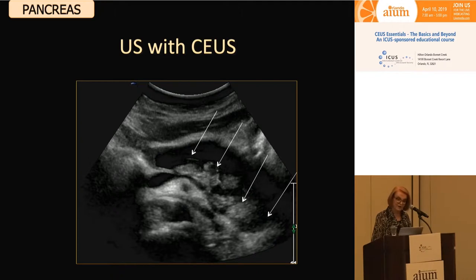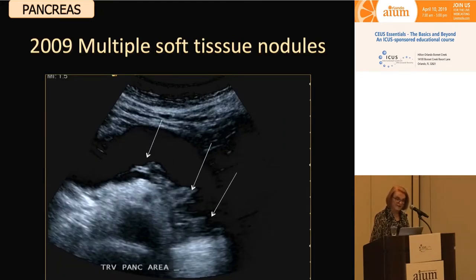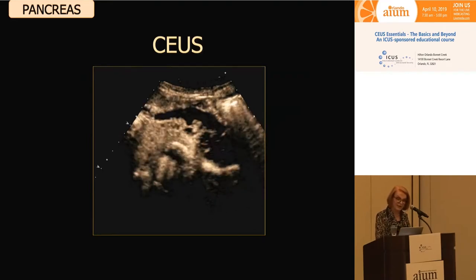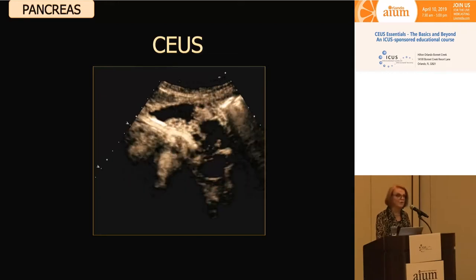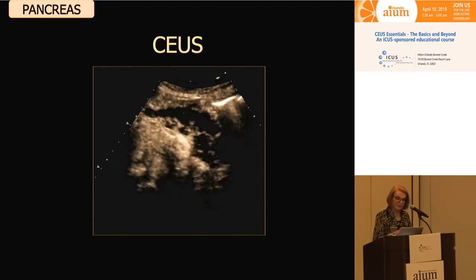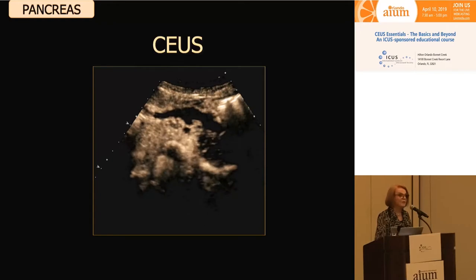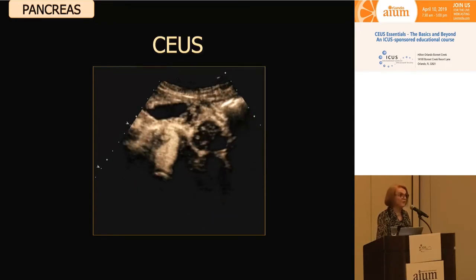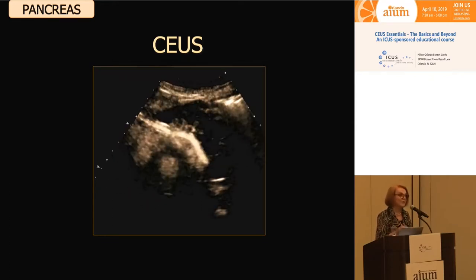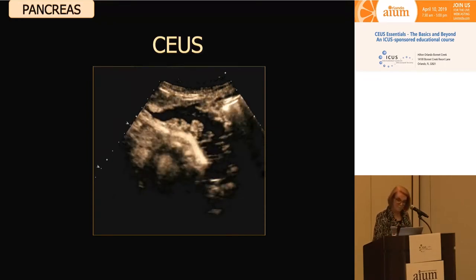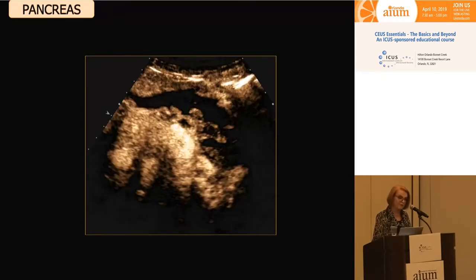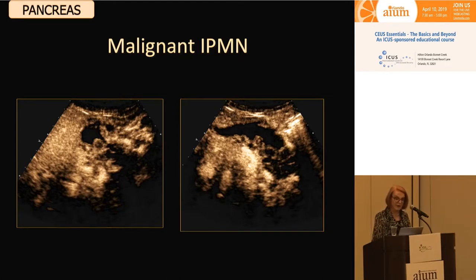Within this dilated duct, there are now multiple papillary excrescences arising from the posterior wall. Looking back at the 2009 scan, those papillary excrescences are there, but much smaller. On contrast-enhanced ultrasound looking at that duct, those are in fact hyper-enhancing nodules within the duct. Ultrasound has improved spatial resolution for showing these papillary excrescences, and CEUS has superior sensitivity to its tracer in the arterial phase. This is a malignant papillary tumor of the pancreas, which was surgically confirmed — a malignant IPMN, beautifully shown on ultrasound.